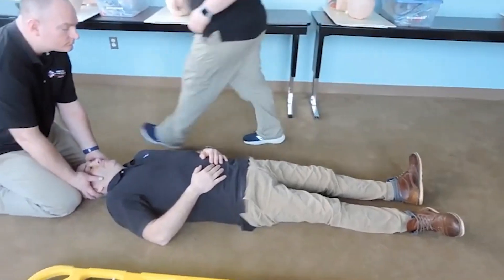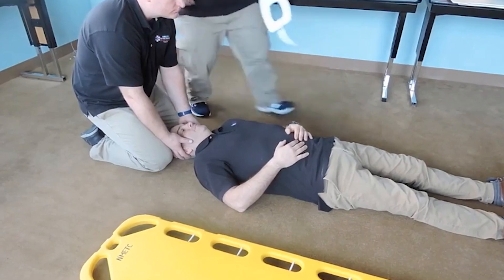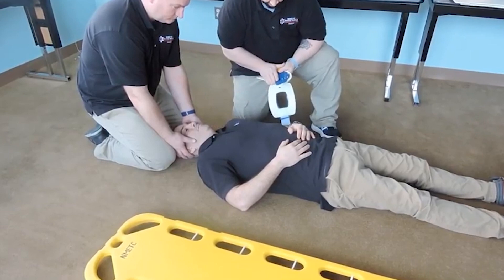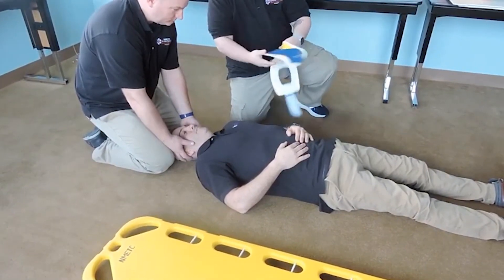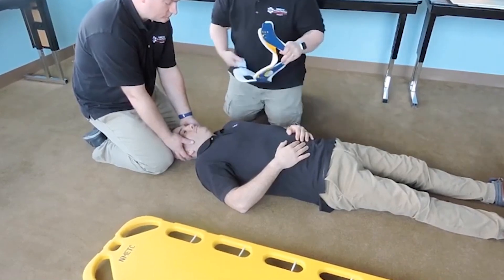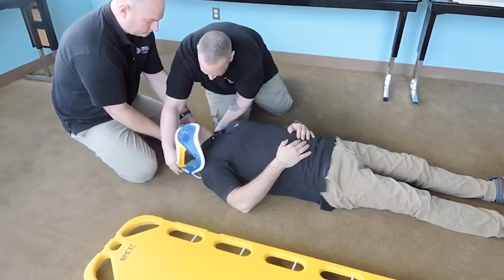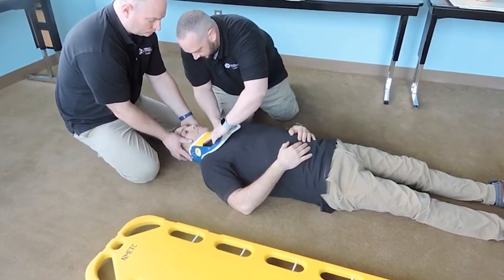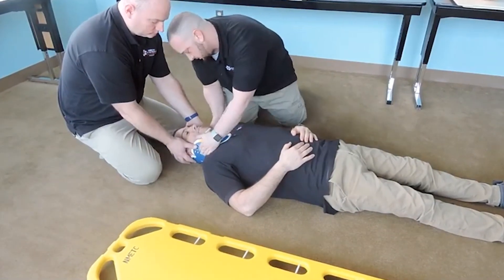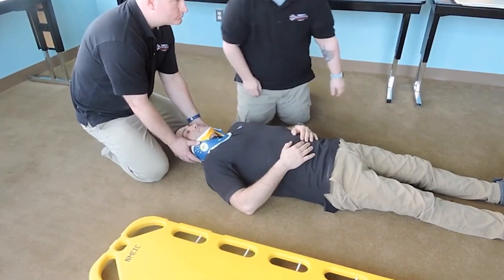At this time I'm going to get my collar. With my partner holding C-spine, I'm going to measure from the trapezius to the angle of the jaw, then measure against where it sits on the collar, making sure it's sized appropriately and locked into place. Working around my partner, I'll slide this through. This will be applied on bare skin — I'm going to scoop this into place and make sure it's secure. The partner will maintain C-spine, and we're still able to see through the window for JVD or tracheal deviation.